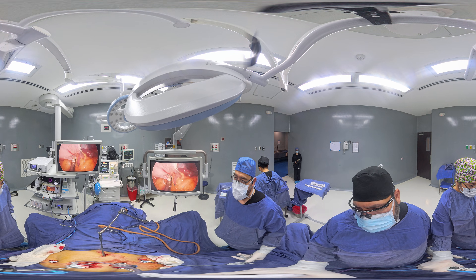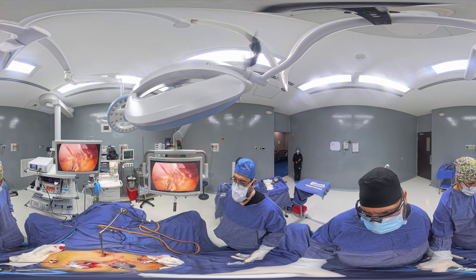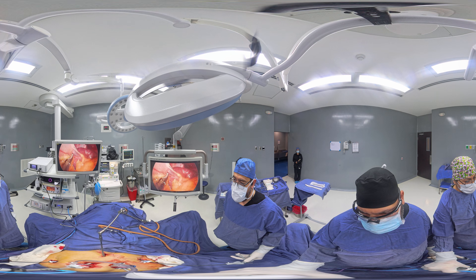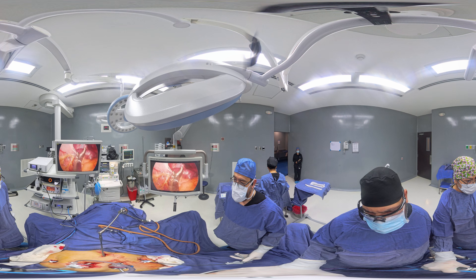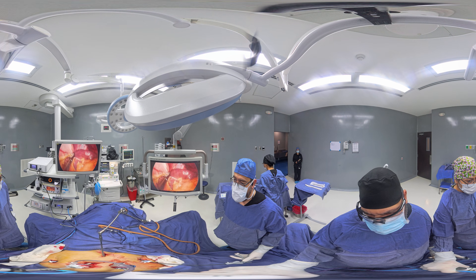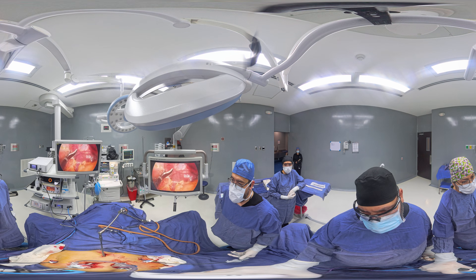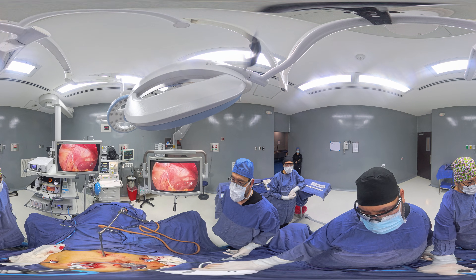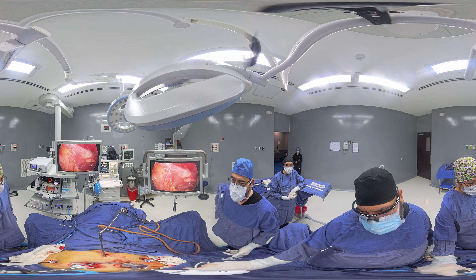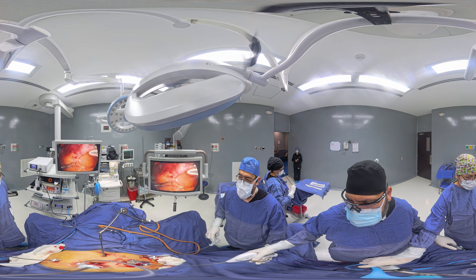This is the last part of the short gastric vessels that connect to the spleen. That organ that you see on your right side of the screen, that's the spleen, and on your left, that would be the stomach. That will be the last portion — the top part of the stomach. We're headed to the lower part of the stomach toward the pylorus now.